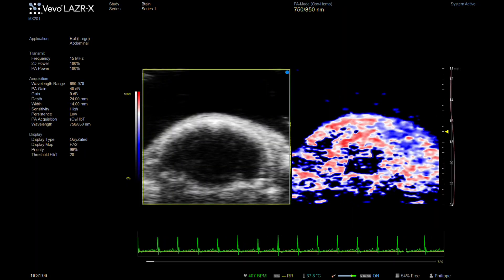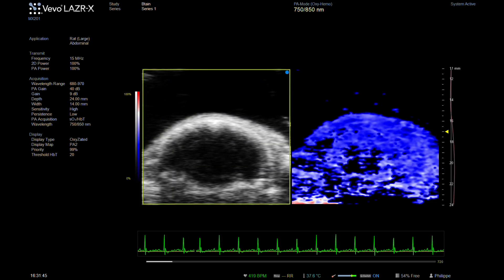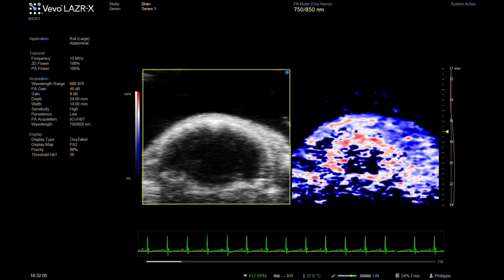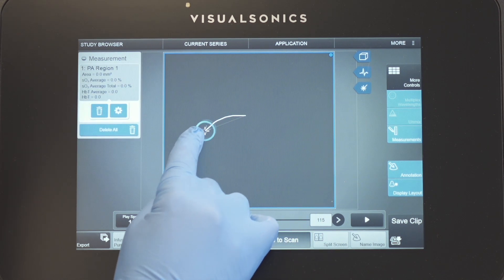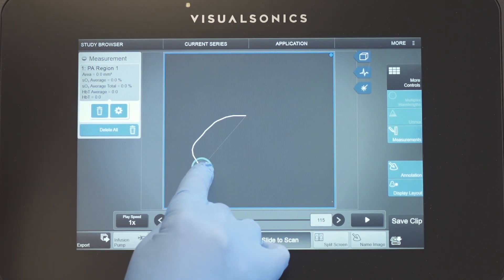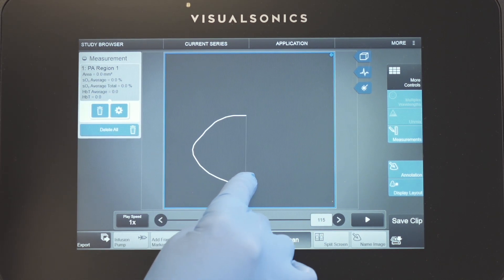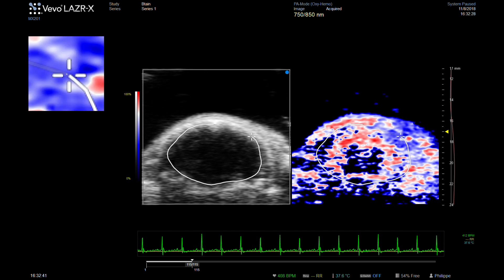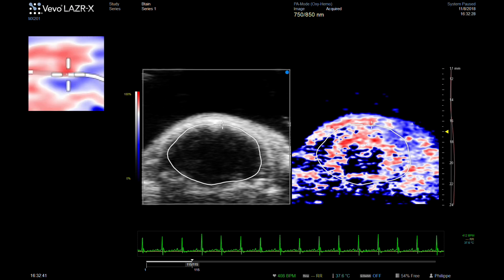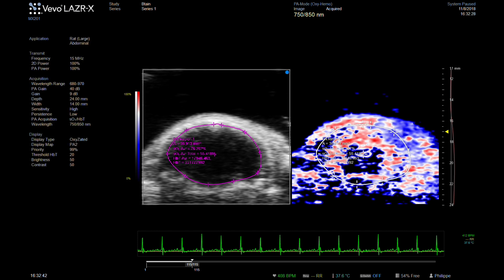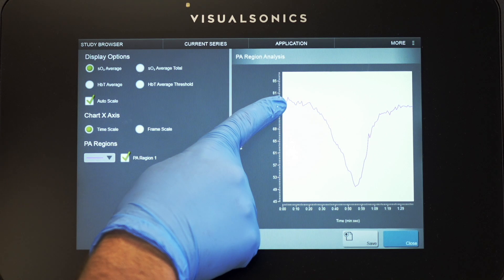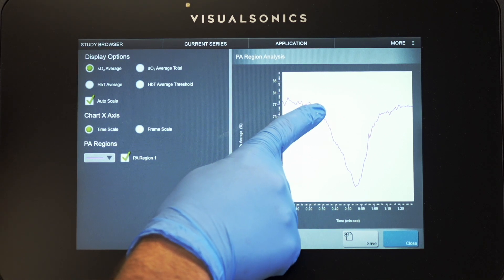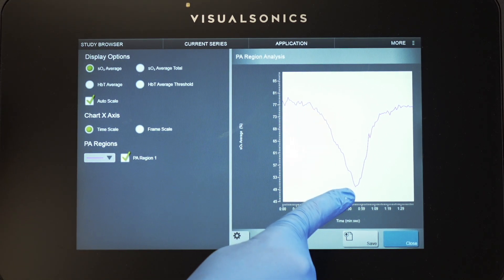You can see how the parametric map changes from red to blue under hypoxic conditions. For quantification, regions of interest can be selected and a graph generated with time on the x-axis and average percentage oxygen saturation on the y-axis. This shows the drop in oxygenation during hypoxia and the increase of oxygen returning to normoxia.